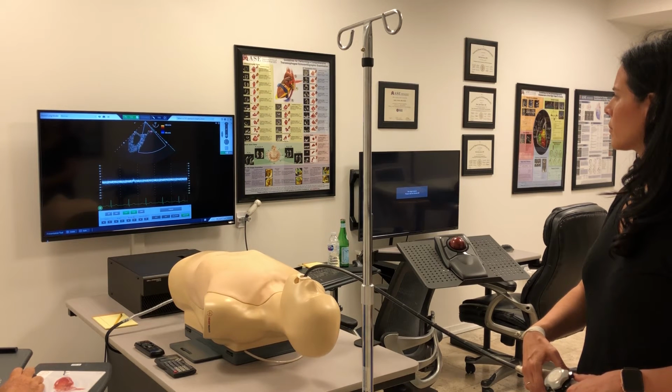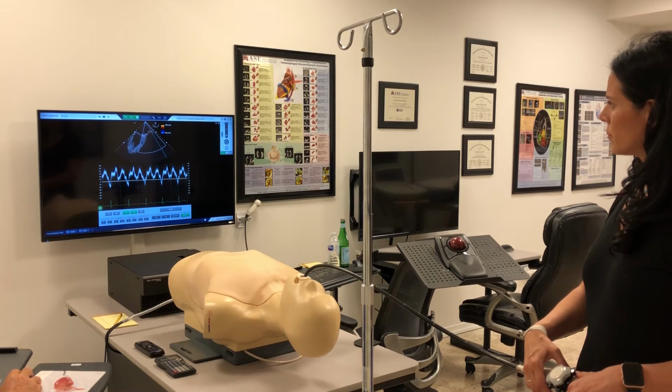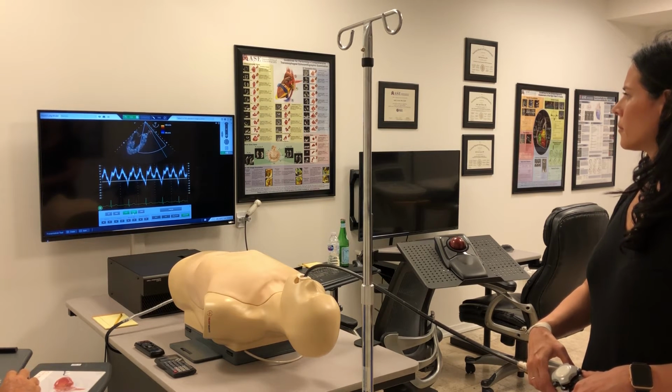And these become very important in determining what kind of pathology you're looking at, be it mitral regurg or some grade of diastolic dysfunction. Here's the typical pattern. Here we see S1 and S2 wave, a D wave, and the flow away from the probe is the AR wave. So beautifully done. Let me turn this off.